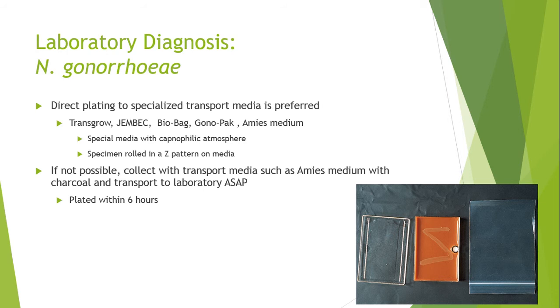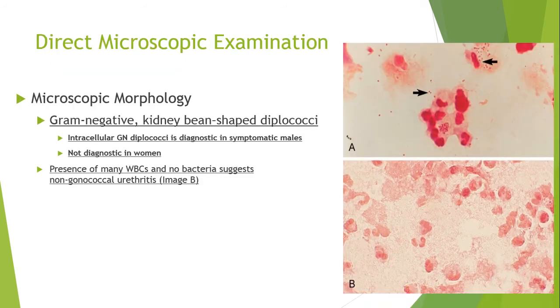If you can't put it on some of these transport media, then you want to use something like an Amies media with charcoal, and transport it to the lab as soon as possible. We want to plate it within 6 hours.